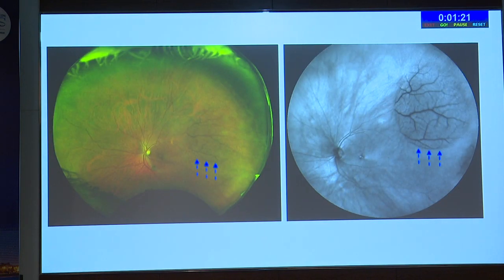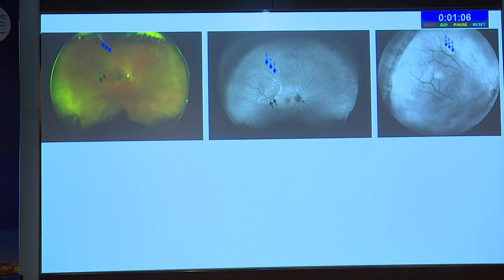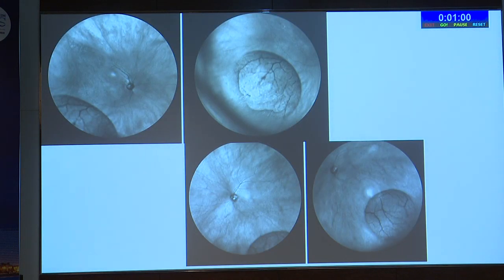Now you can see a wide field fundus photograph. This is a patient of retinoschisis, and this infrared technology can highlight this elevated lesion much better. You can see the true extent of the bulla much better with infrared technology, and it is better than autofluorescence. You can delineate this elevated lesion, and infrared images have been one of the suggested modalities for documenting the progression of schisis. It is more sensitive than fundus photography.